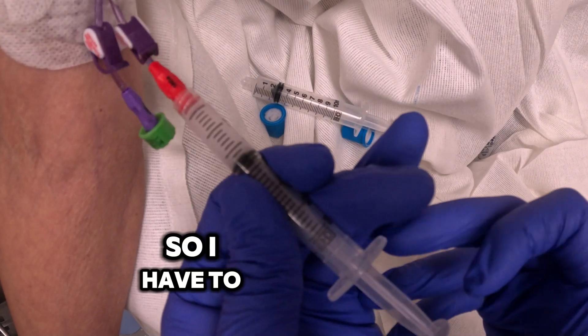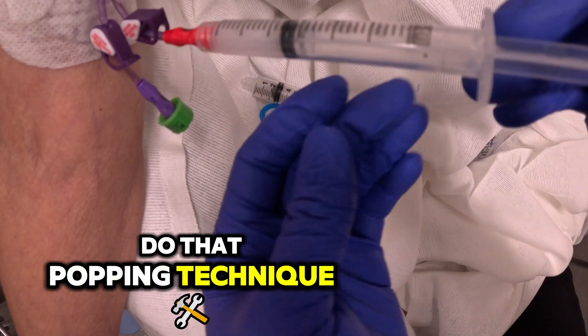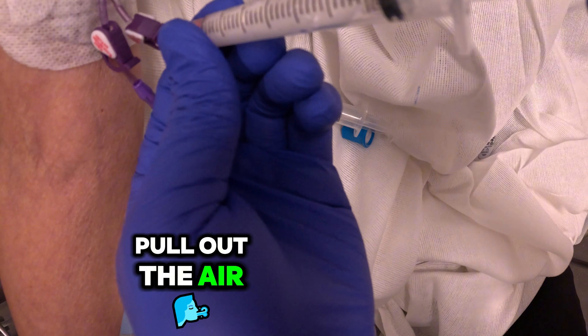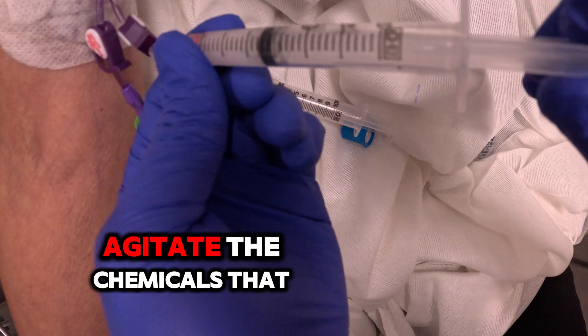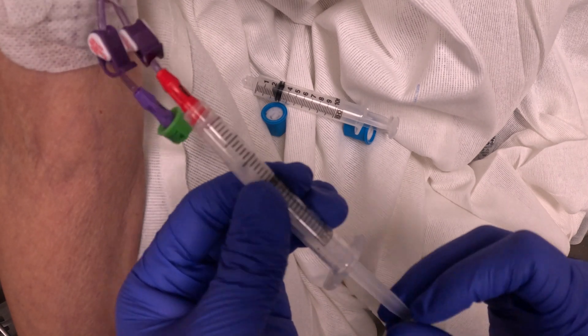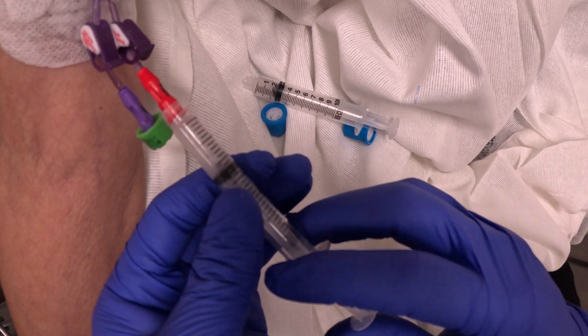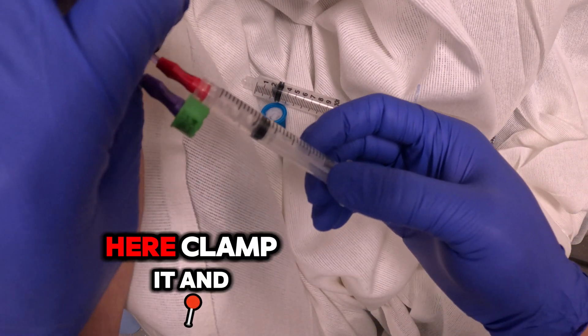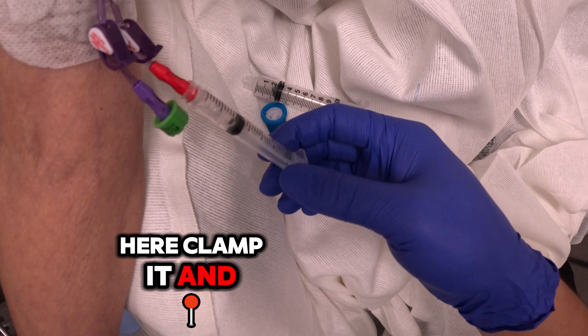I have to do that popping technique, but we're going to make sure we get rid of all the air. Pull out the air and agitate the chemicals so that the alteplase will actually reach all the way to the clot. Now I'm going to sit here, clamp it, and we're going to wait.